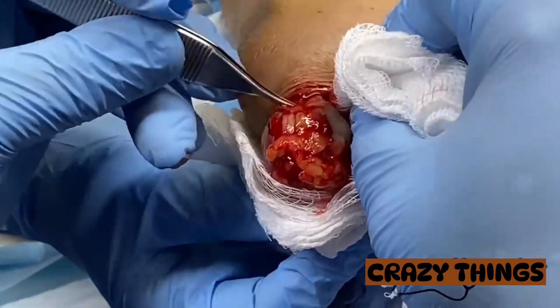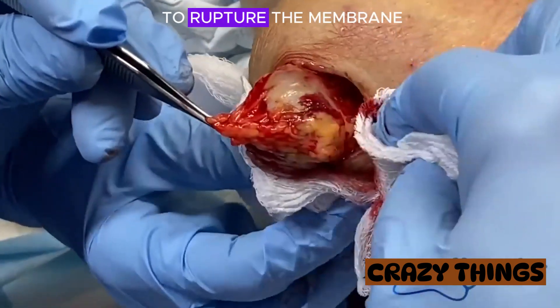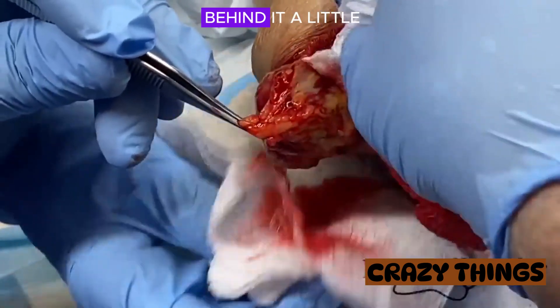See the small capillaries just there? So at this stage, I'm not trying to rupture the membrane. It's actually better when it's intact and tense — I can see behind it a little bit better.